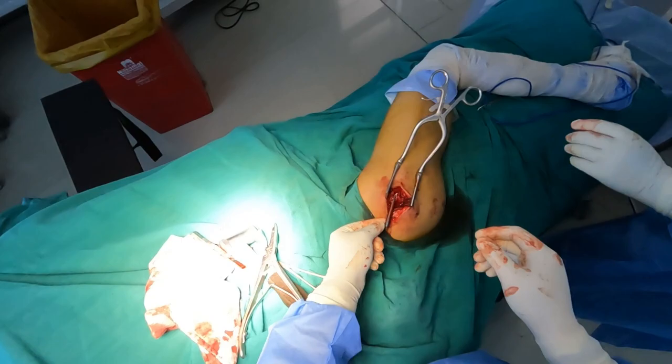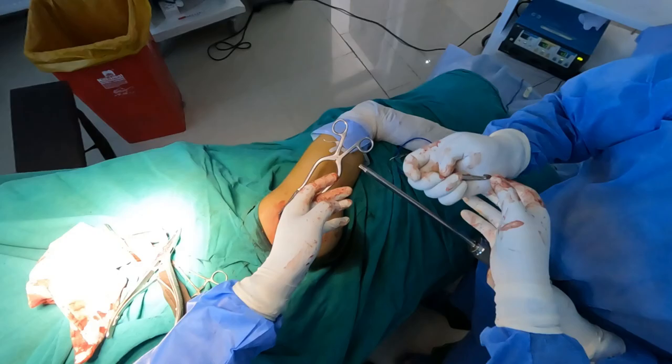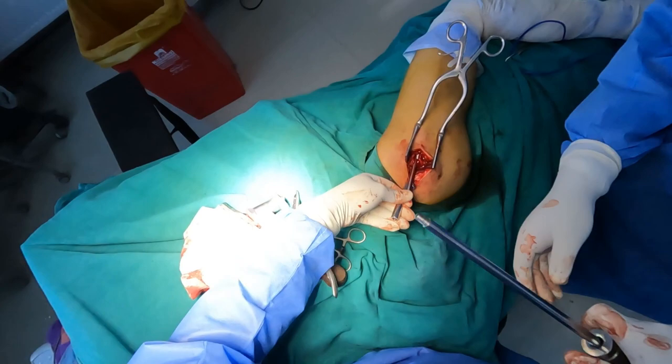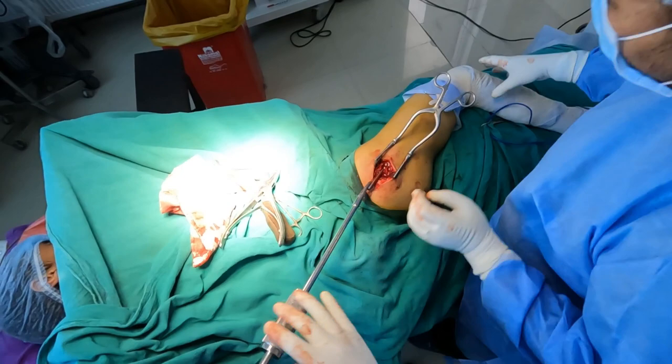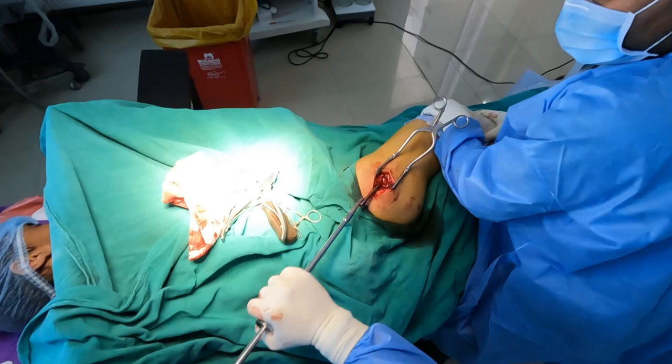Now it has got stuck. Once the K nail has been extracted to this length, one can easily see the eye of the proximal K nail. I am putting a hook into that eye of the K nail, which is being attached to an extractor hammer. Once it has been properly fitted, with the help of gentle strokes I am removing the K nail.